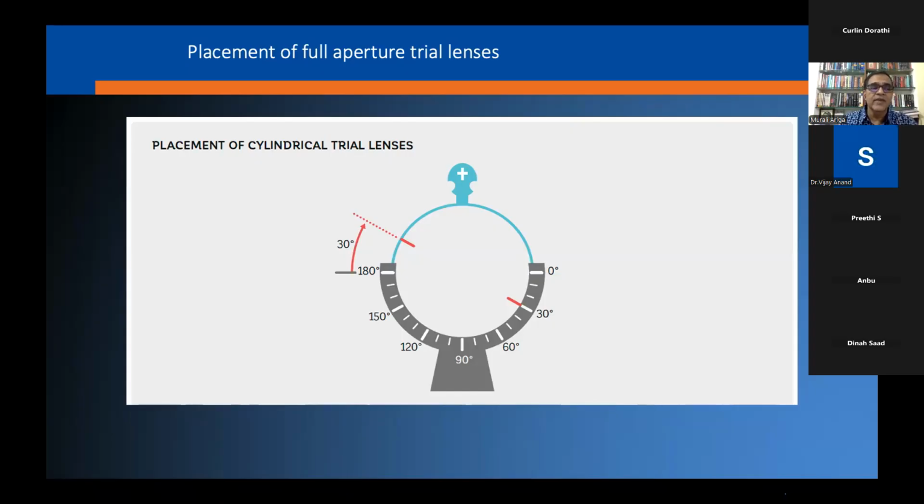And also you will find people with high myopia and aphakia, very high refractive errors, say more than 6 or more than that. I would generally like to do the visual field with a contact lens in place. That will actually give a better visual field test outcome rather than putting in these kind of trial lenses for high refractive errors, especially aphakia and high myopia.